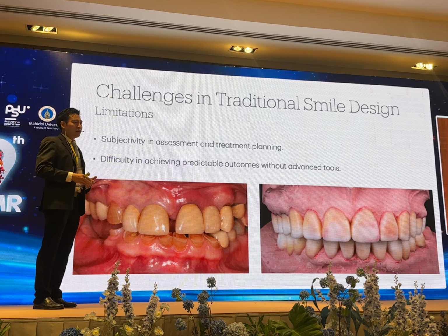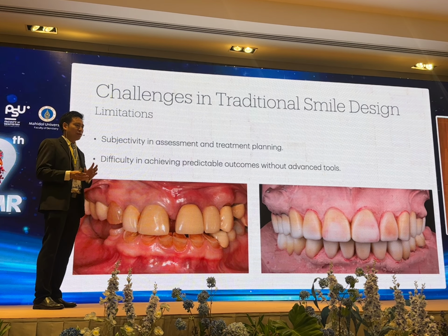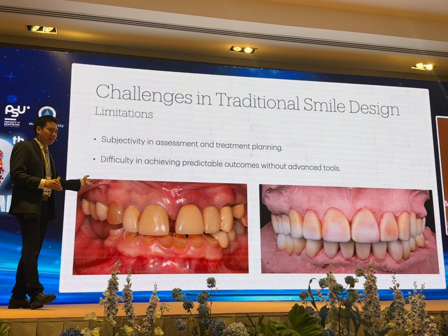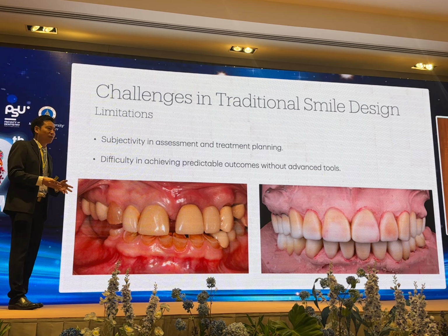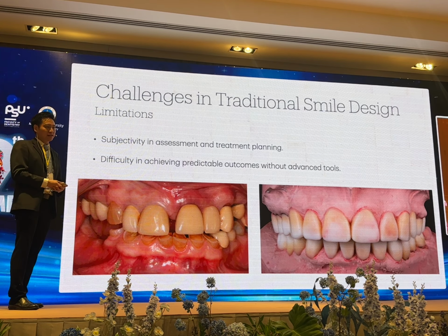In a traditional way, when we want to restore the teeth for the patient, if you don't have much experience, if you're a beginner, most of the time when you see a case like this, you're thinking, okay, how do we put the teeth together, how do we close the space, how do we make them occlude with each other.